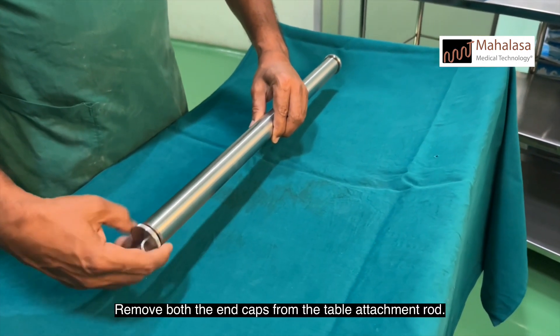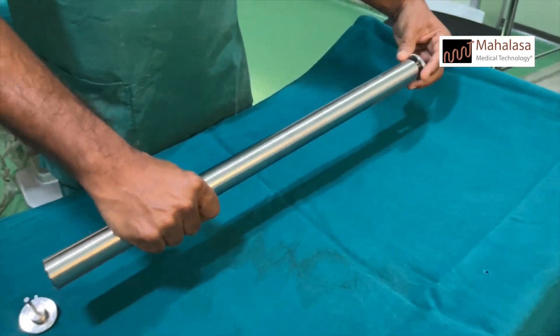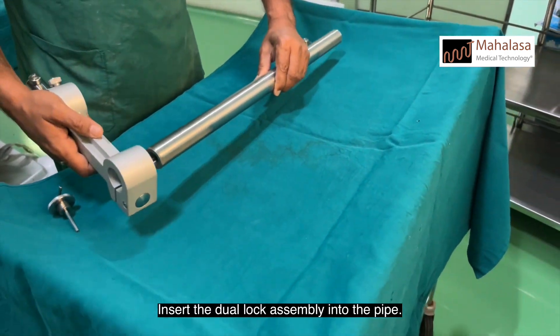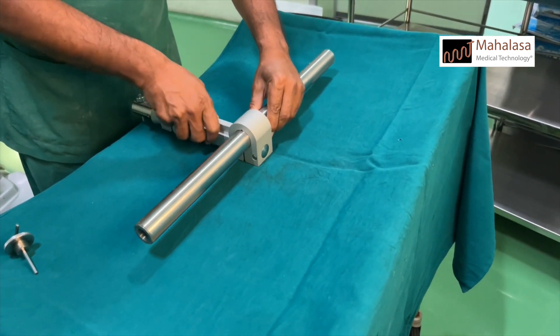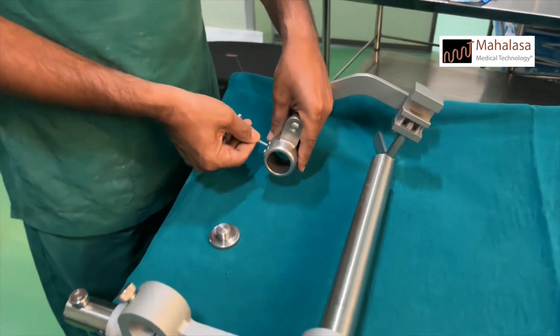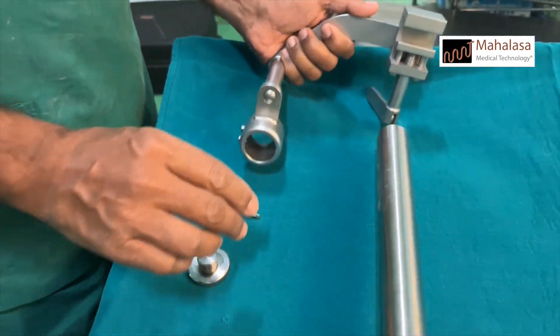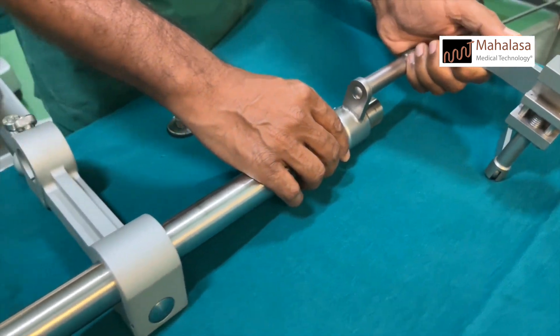Remove both the end caps from the table attachment rod. Insert the dual lock assembly into the pipe. Unlock the grub screws in the side railing clamps. Insert the bush of the side railing assembly into the TA rod.